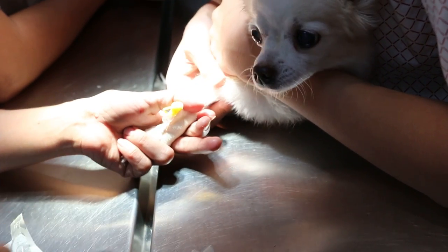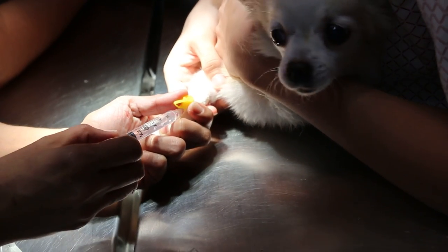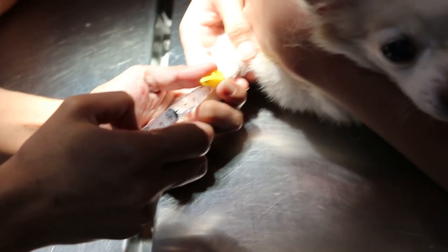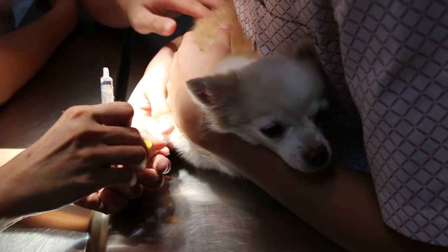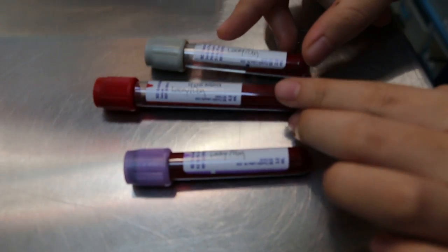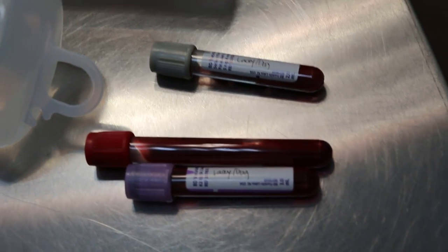1ml of Hartman and then glucose — 1ml glucose. Very slow — you can see the difference. This is IV: Baytril given, Buscopan given, Hartman and 5% glucose given. So the dog doesn't have to eat or get dehydrated. We took the blood — three bottles. The blood will be used to check for kidney function, liver function, and total white cell count to see whether it's increased. White cell increase is due to bacterial infection or viral infection as a cause of diarrhea.